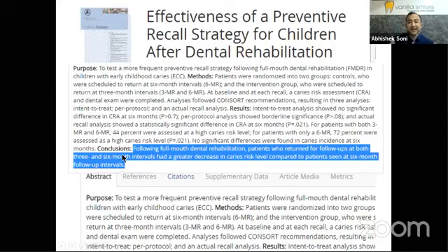A lot of general dental practitioners, colleagues who are placing crowns in their practices for children, this is one technique to look for, because this is one technique where you actually don't have to open or lift your aerotor. So this is a technique which falls into the category of the much hyped aerosol-free pediatric dental procedures.